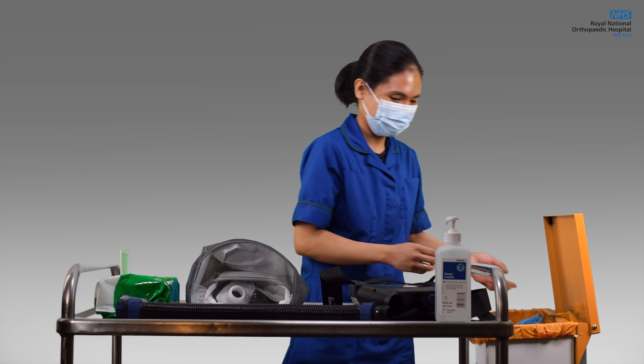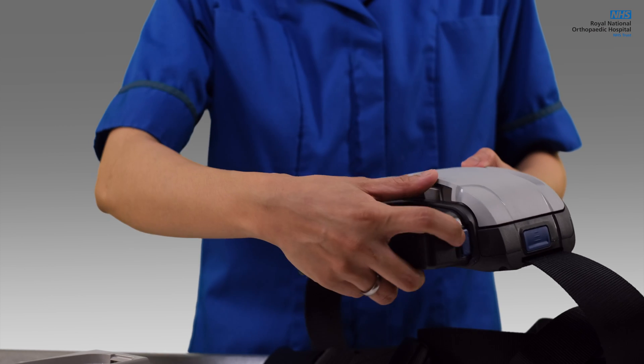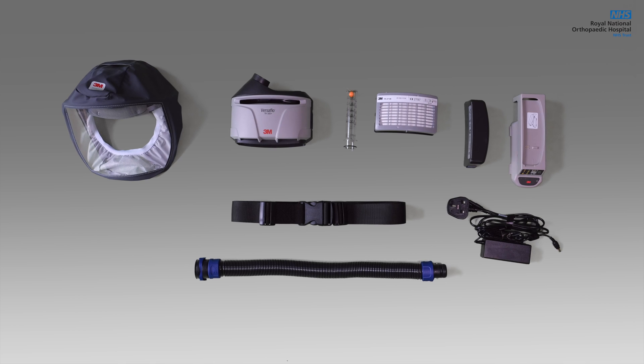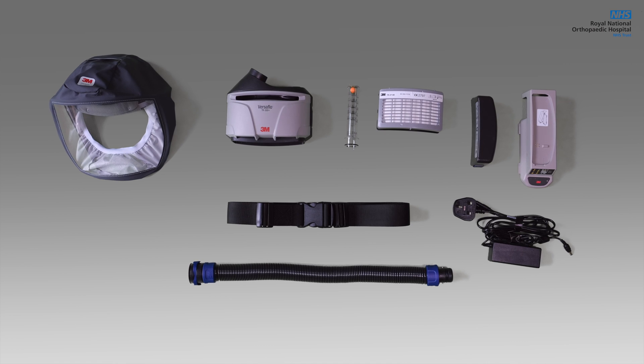Finally, take your gloves off and clean your hands. If a charger is nearby, take the battery off the unit and allow it to charge. It is important that all the parts remain together for ease of use and to avoid items being lost or damaged.